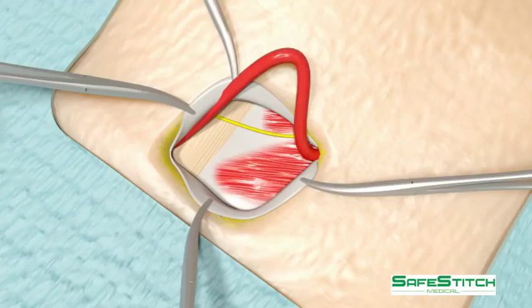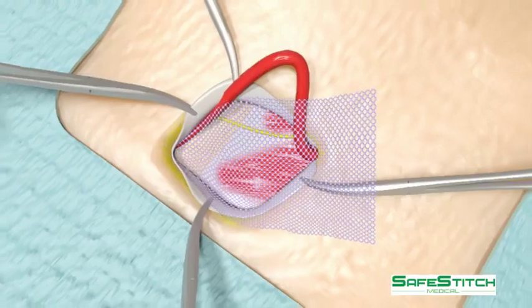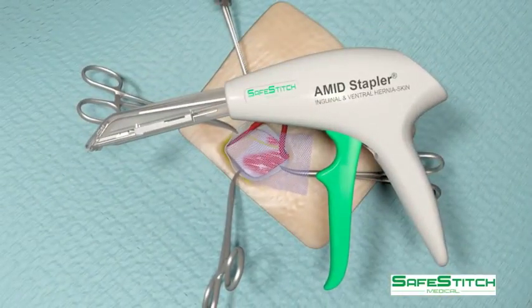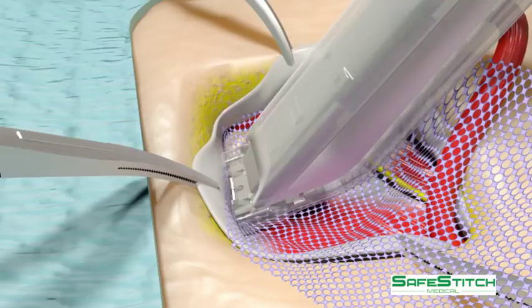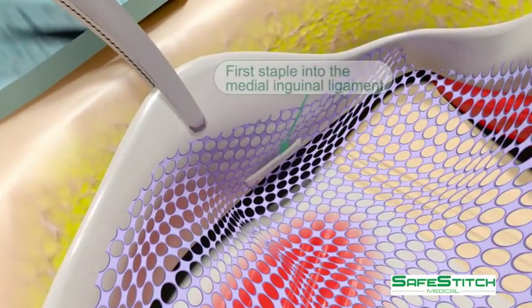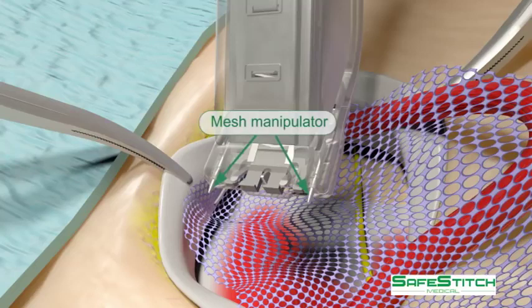the spermatic cord is retracted and the previously cut mesh used for a Lichtenstein repair is introduced. The Amid stapler is used to first fix the mesh to the medial aspect of the inguinal ligament, being careful that the mesh extends 2 cm medial to the lateral border of the pubic tubercle. The mesh manipulators are demonstrated. They are static and are used to position the mesh.